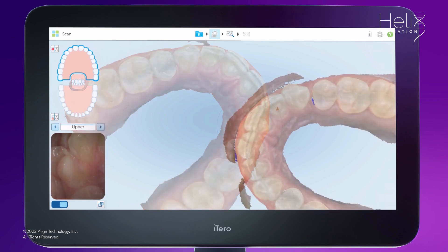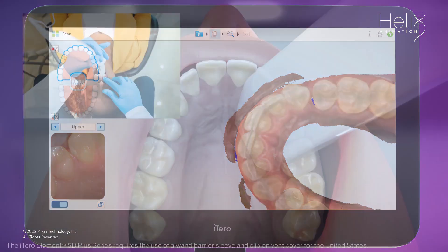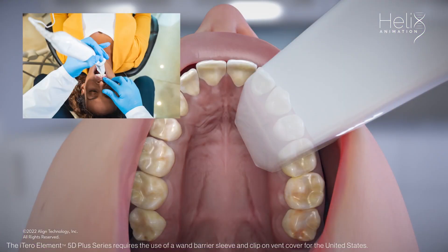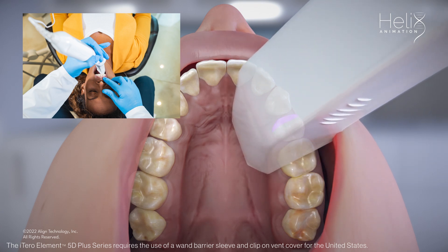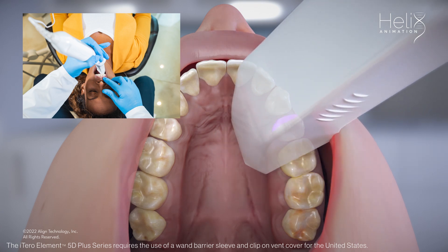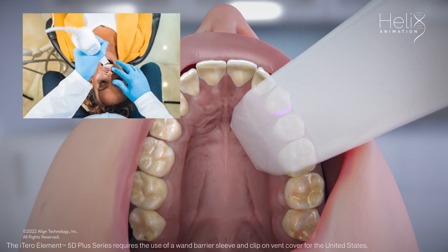After completing the upper scan, I noticed there was missing anatomy on the mesial lingual of a tooth. To capture the missing anatomy on the upper lingual mesial, start by bringing the cable end of the wand out to the side you are scanning, then use a twisting motion to fill in the interproximal. Twisting the wand back will capture the distal.